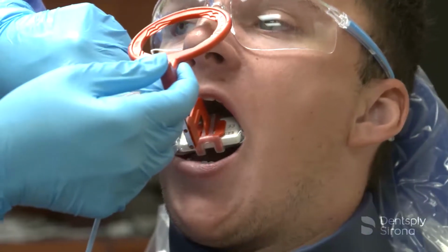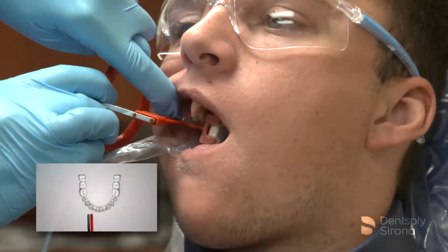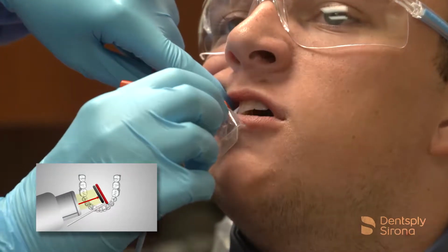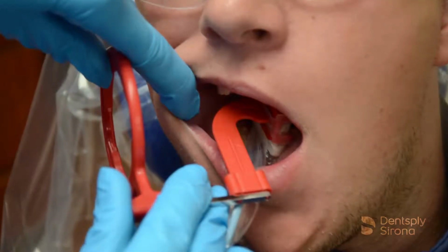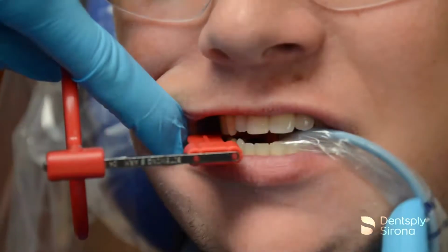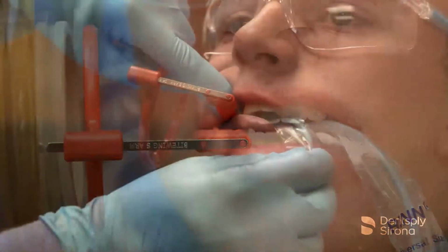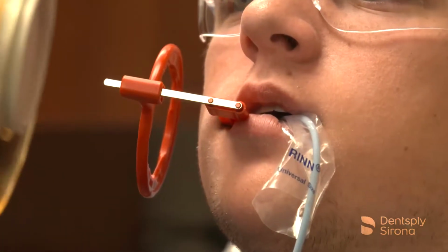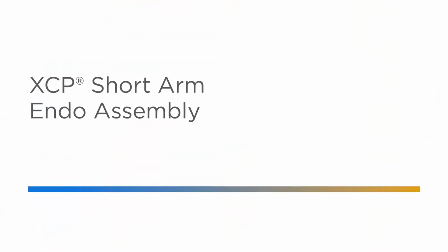When placing the sensor for bite-wing images, allow the sensor to find its place in the mouth comfortably. It is important to remember when aligning the sensor for premolar or molar bite wings, the central ray must be perpendicular to the image receptor. This will aid in opening the contacts, producing a quality diagnostic image. Place the bite block behind the teeth being captured, ensuring that the central ray is perpendicular to the sensor. Instruct the patient to close slowly and utilize the handheld portable X-ray device to acquire the image.